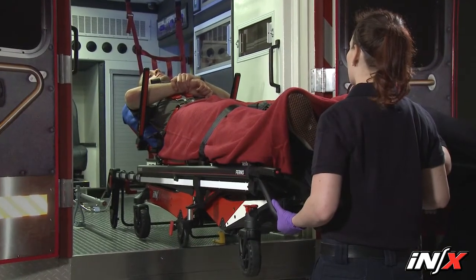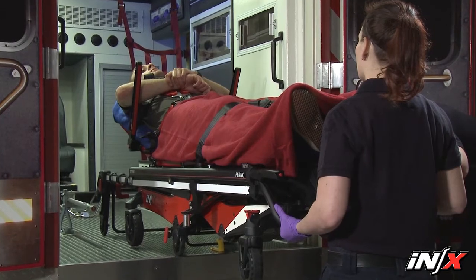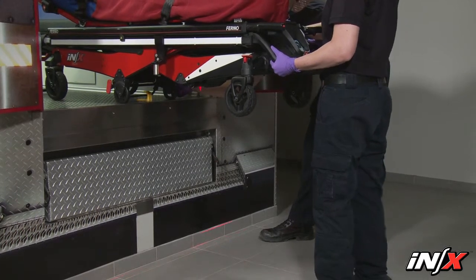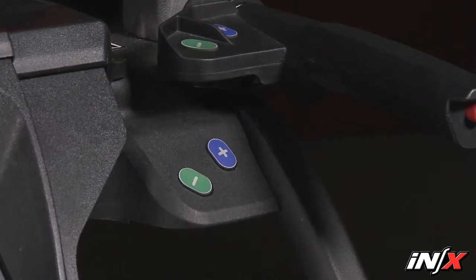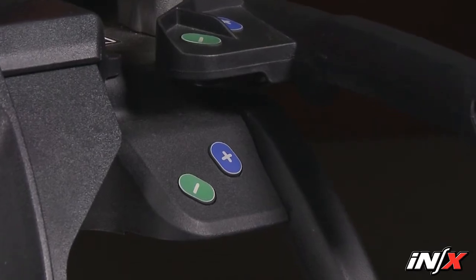Support and balance the control end of the NX while the control end legs are off the ground. Be aware that the terrain around the ambulance can affect the loading height. If uneven ground or an incline prevents the NX from rolling smoothly into or out of the ambulance, press the plus extend or minus retract button to adjust the height as needed.